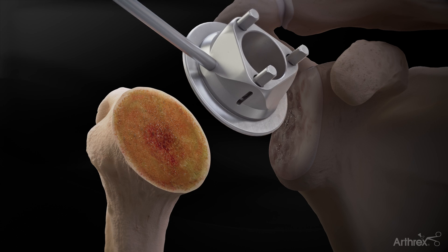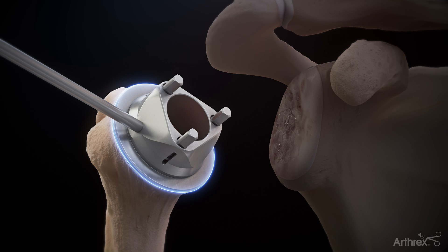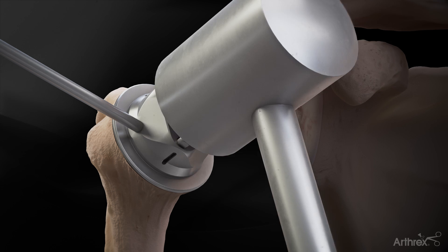Determine the required trunnion size by using the provided coring templates. The appropriately sized template should match the cortical rim without any overhang. The pins are impacted into the resection to hold the template in place.